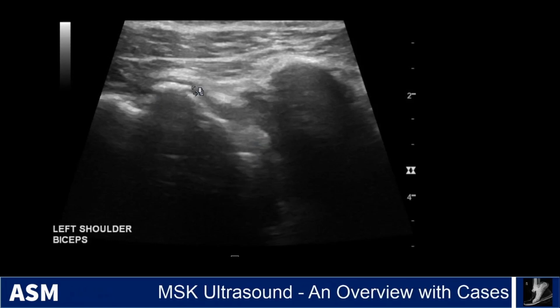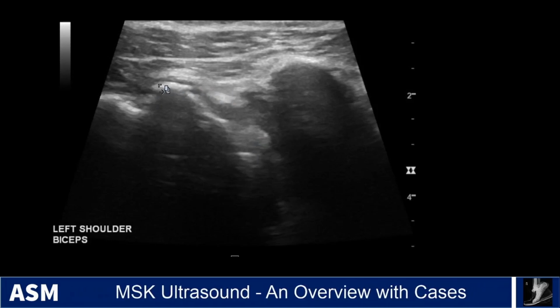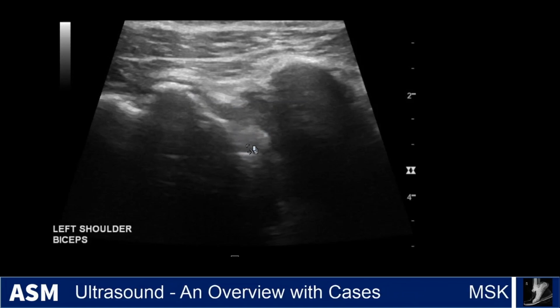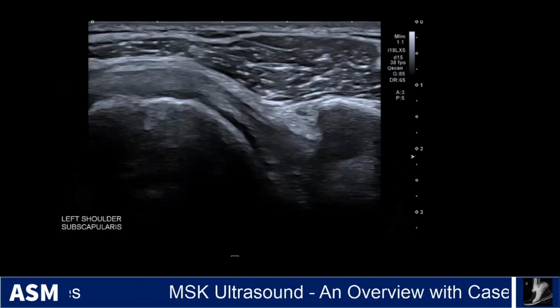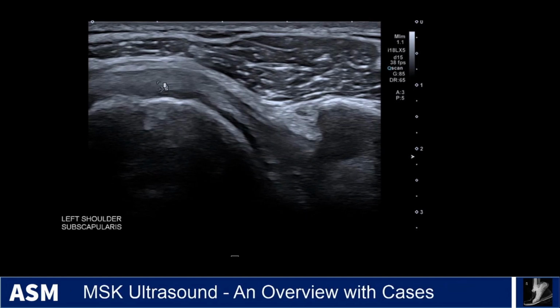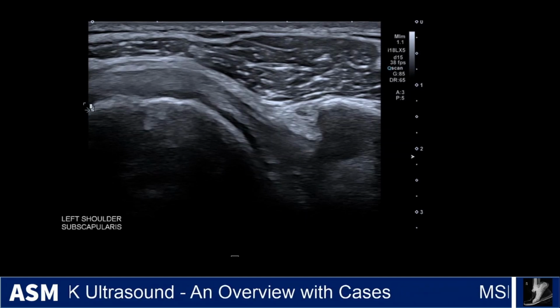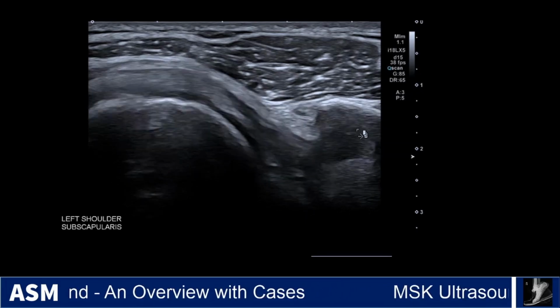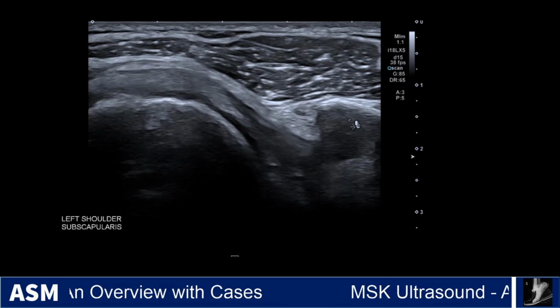So this is a full thickness subscapularis tendon tear, a biceps pulley rupture with a dislocation, an intra-articular dislocation of the biceps tendon. We compare this now to an intact subscapularis tendon here, the lesser tuberosity. Over this way, the biceps tendon will be coming into view. The conjoined tendon and coracoid process are actually at the level of the coracoid here.